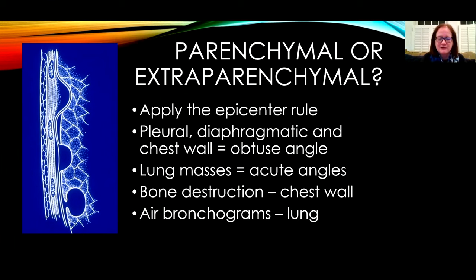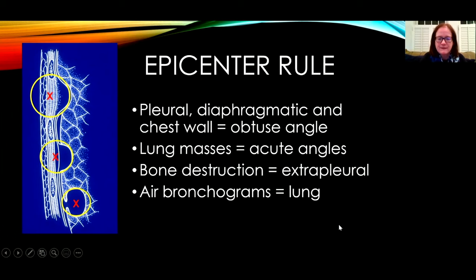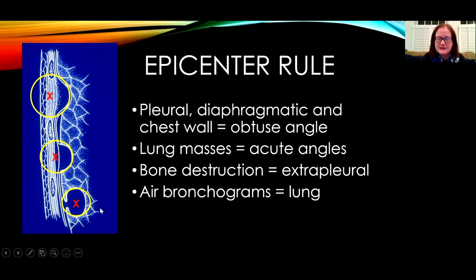There are other features we look for as well, such as bone destruction which often indicates a chest wall lesion, and if you find air bronchograms that will indicate a lung lesion. By using the epicenter rule, we draw a circle continuing from the lesion and then determine where the center of that lesion would be. The uppermost lesion has its epicenter outside of the lung, in keeping with a chest wall or pleural lesion, whereas the lowermost lesion has its epicenter in the lung, indicating it's a lung lesion.